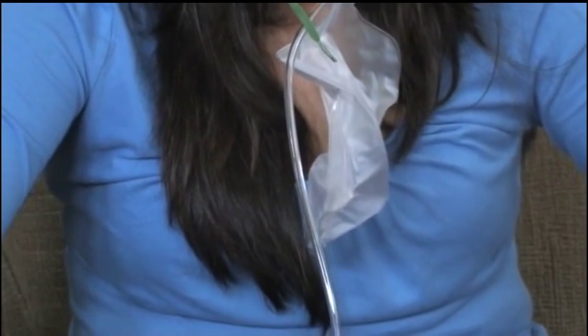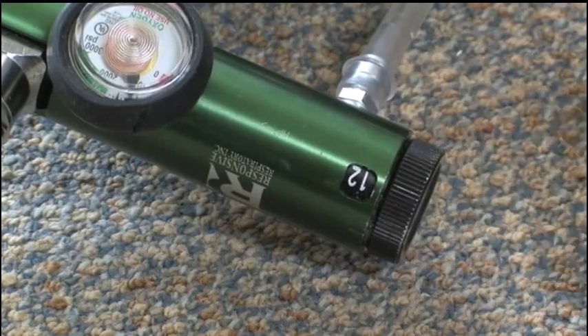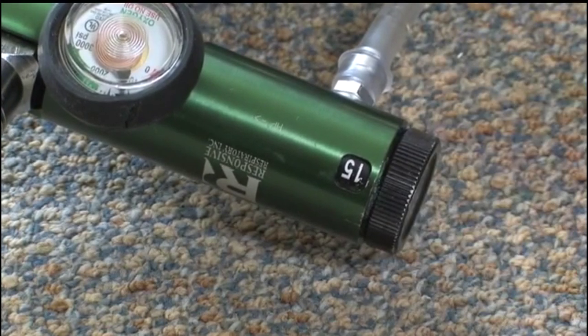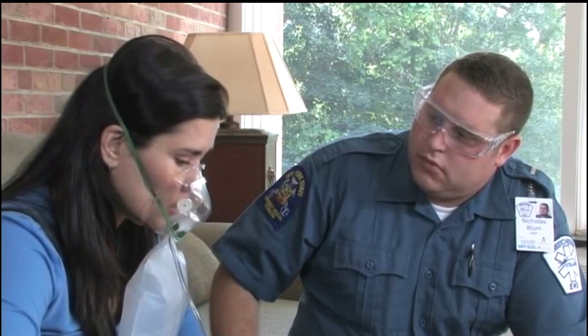If the bag is not at least half full, the patient is over-breathing and you will need to increase the flow rate slightly. Most regulators will allow an increase in flow up to 25 liters per minute. Reassurance and encouragement will help reduce the claustrophobia sometimes associated with any oxygen mask. You might also have the patient hold the mask on his or her face, reducing claustrophobia even more.